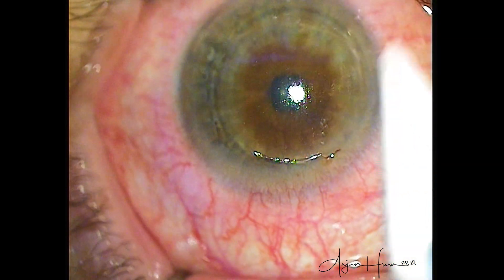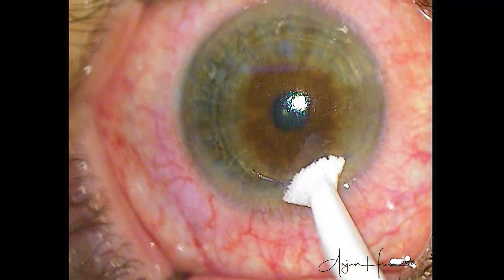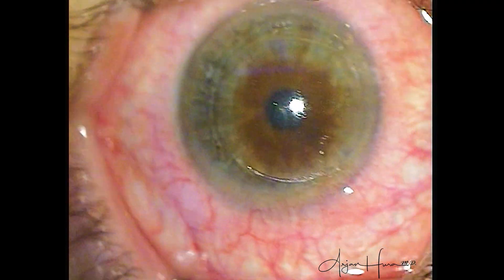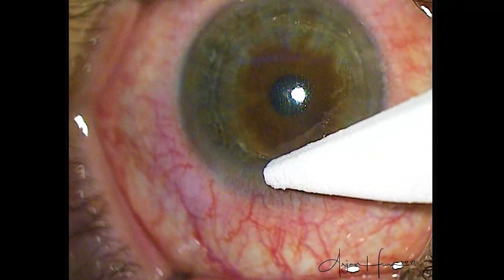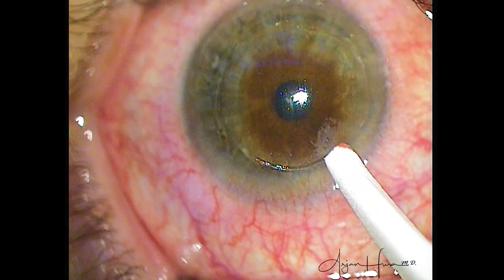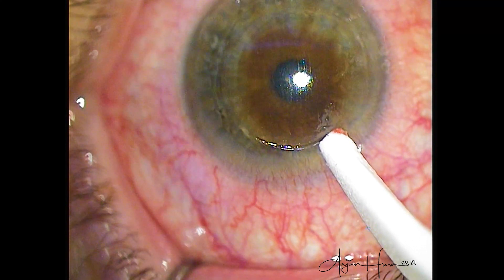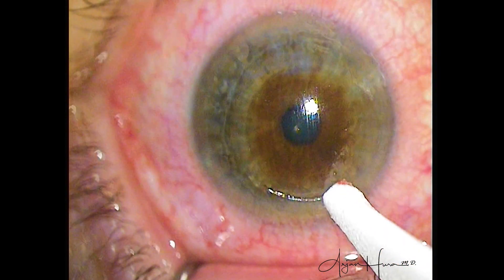This eye looks great, but you can tell there's still a little bit of oozing at the edge of that incision. So I'm going to apply a little bit of mechanical pressure with the Wex-cel sponge — that should crimp down on some of those blood vessels. These sponges are actually made of cellulose, which is hemostatic in nature. But here you can see it's still bleeding, and capillary action is just going to pull the blood all the way through that incision, with a risk of it cascading into the interface. I could sit here and hold pressure for five or ten minutes, but it's not really the most efficient or effective way to stop the bleeding.